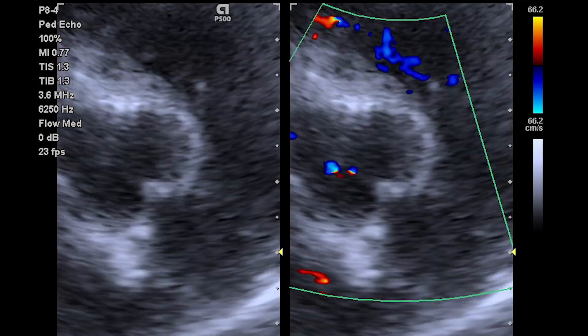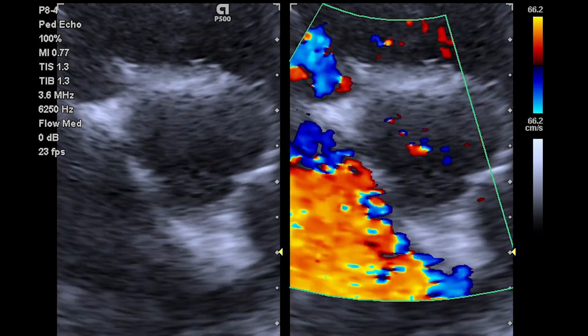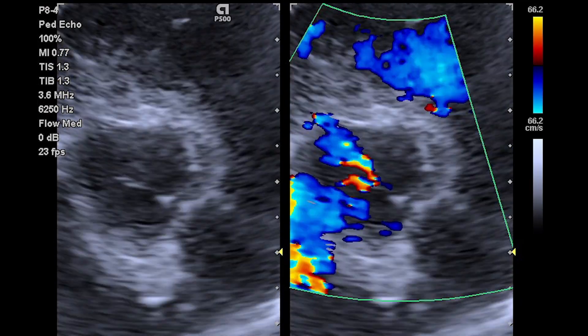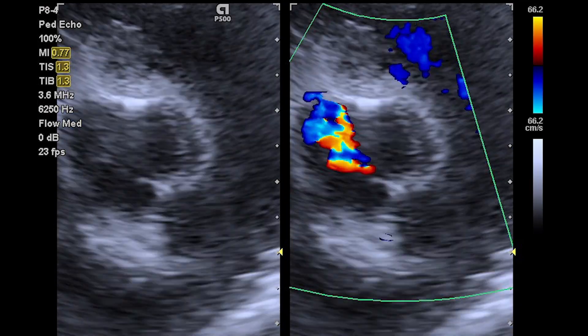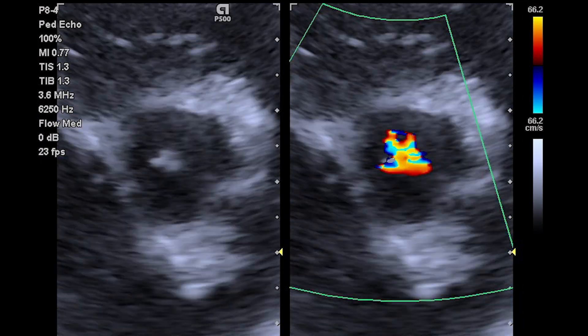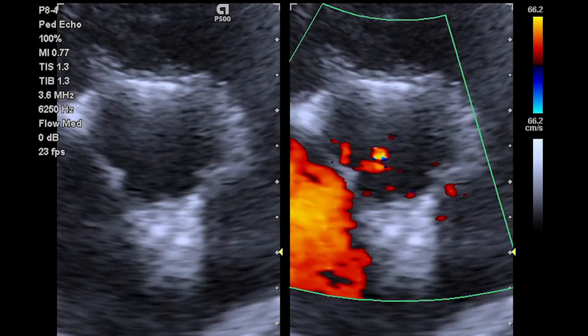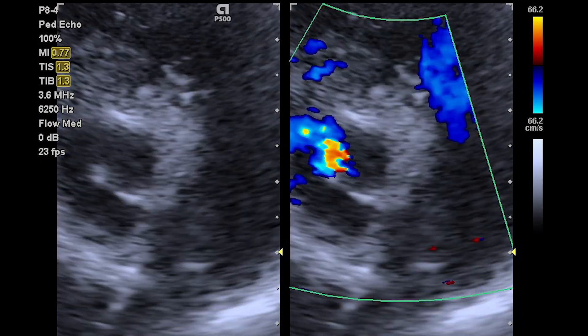Split screen mode is really useful when examining valve disease. This is because there's so much turbulence going on with your colour Doppler, often the underlying structures are obscured. In this example of aortic regurgitation, using split screen allows us to check that we're properly aligned over the aortic valve.